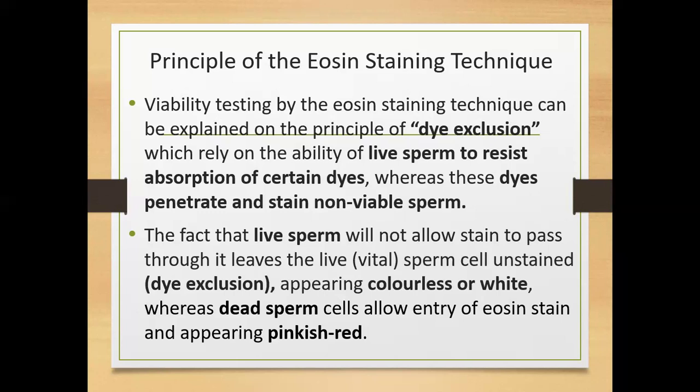The eosin is a supravital stain. When you say supravital stain, what is it? A supravital stain. What is it? Supravital staining. I'm sure you've heard about supravital staining and intravital staining. What is supravital stain?